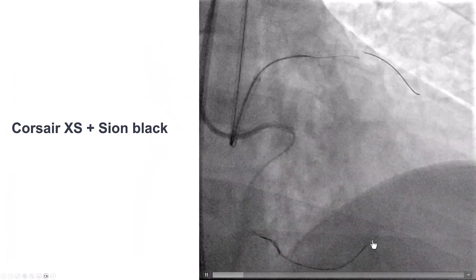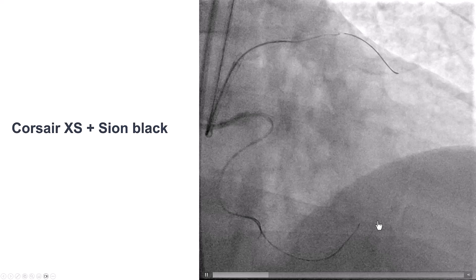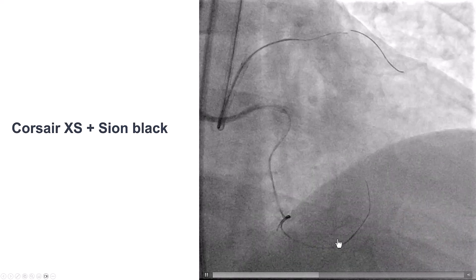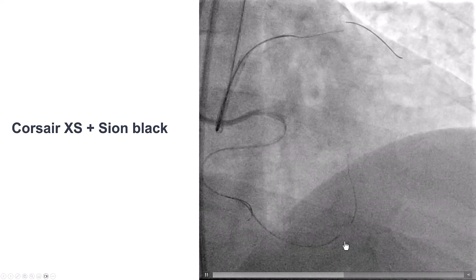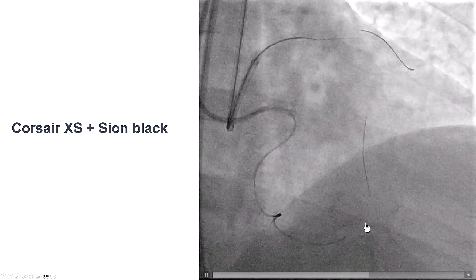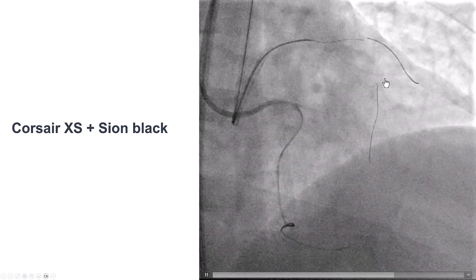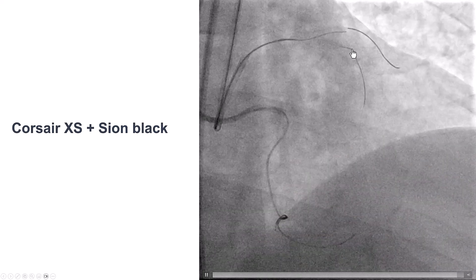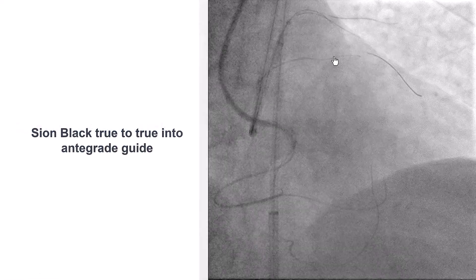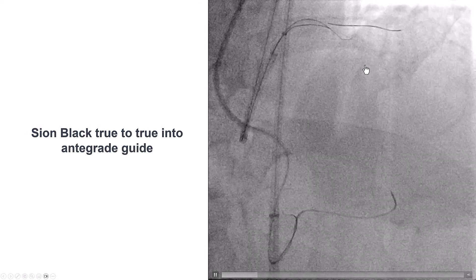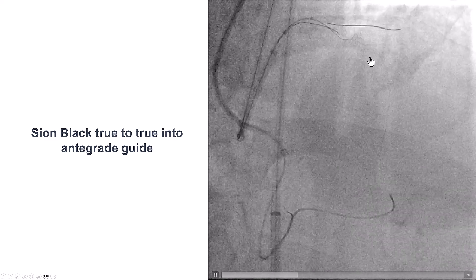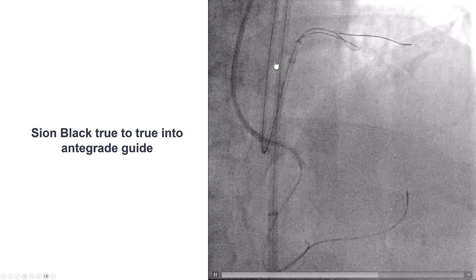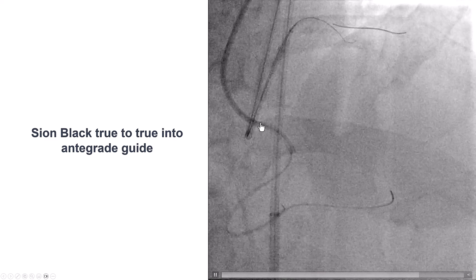We used a Corsair XS and a Sion Black guidewire that did advance. Usually the beginning part from the PDA to the LAD is harder, and after that part is navigated it's easier to advance the guidewire more proximally. Sure enough, the wire went all the way to the LAD. To our pleasant surprise, the same Sion Black guidewire easily went from the distal true lumen into the proximal true lumen and into the antegrade guide catheter.